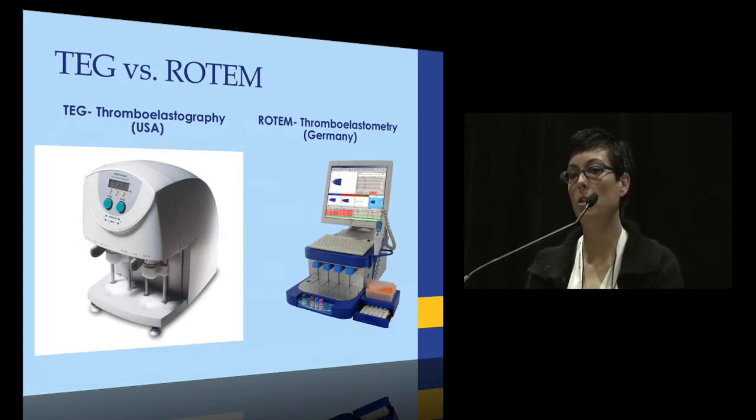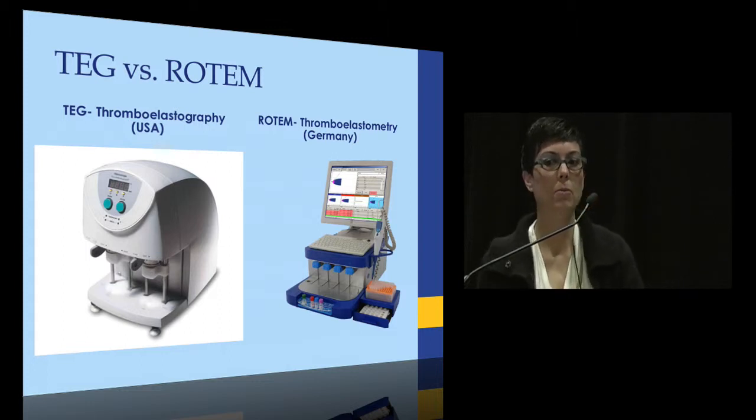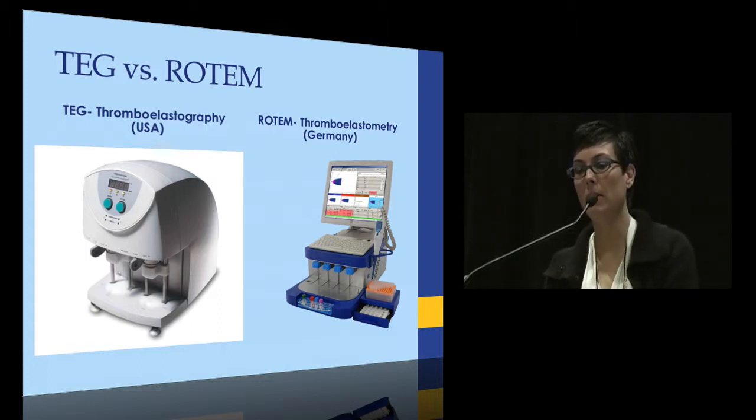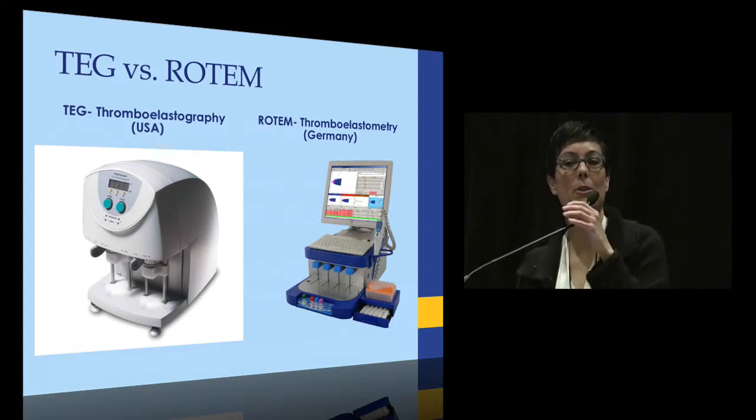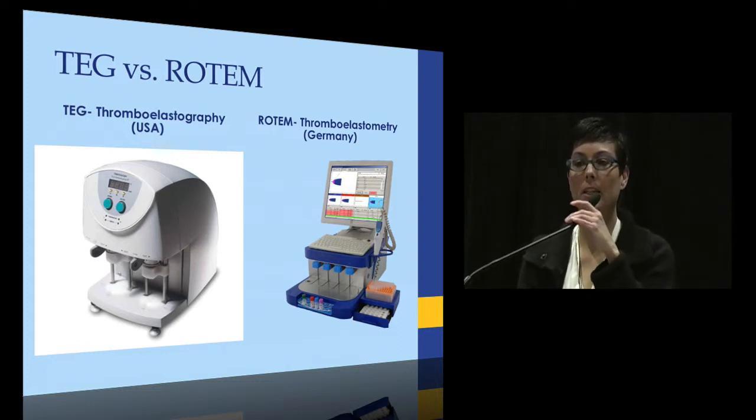These are two different machines. You can see them there. I showed this slide to my husband, who's not a physician, and he said, "Wow, that looks like an espresso machine. When can we get it?" So they do look kind of cute and fun, and I'll hopefully try to delineate the differences between the TEG and the ROTEM.